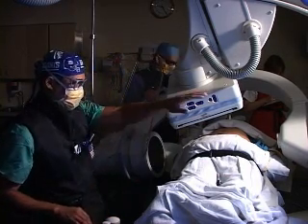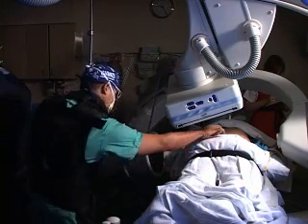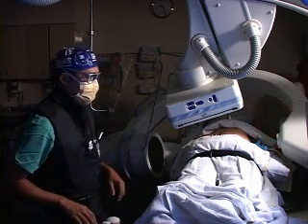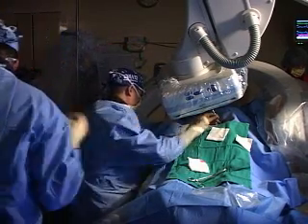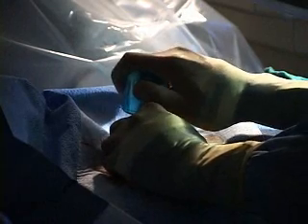Now I've aligned everything in a true lateral. There's a threaded cannula — I'll be able to deliver the biopsy and the osteotome device all at the same time. Getting it through the bone right now.